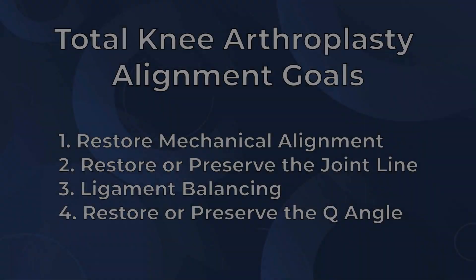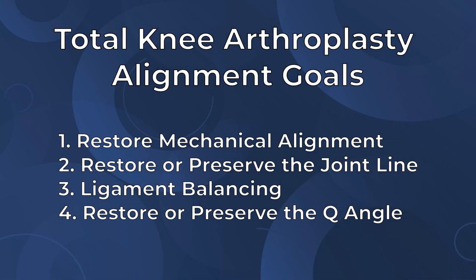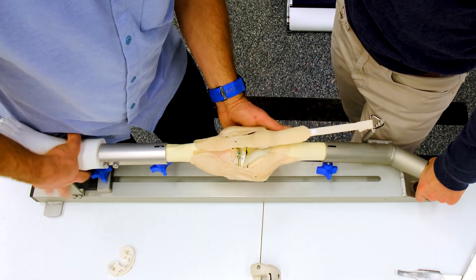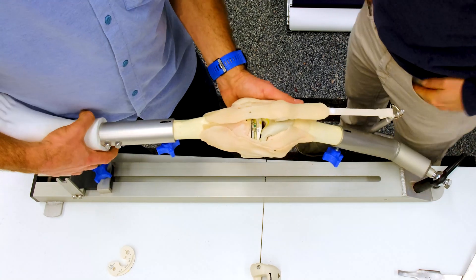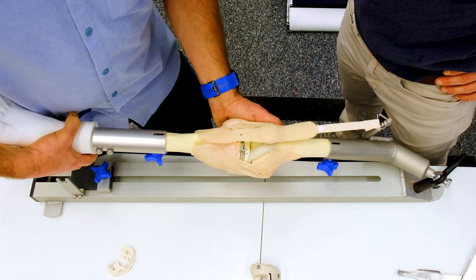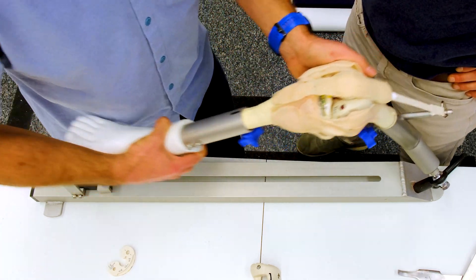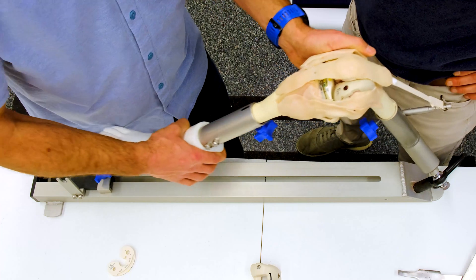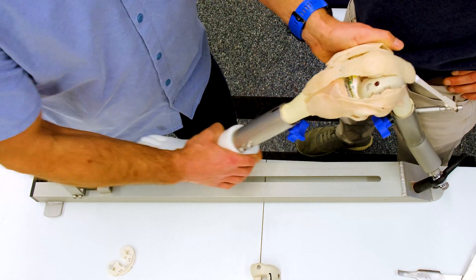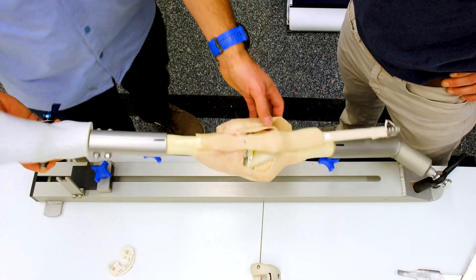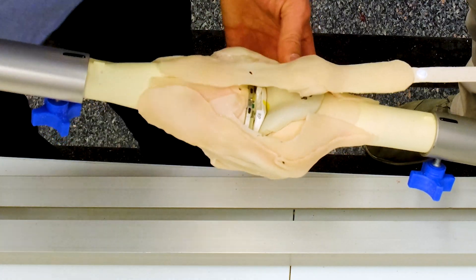We have just gone through a demonstration of a total knee replacement. We're at the trial stage and we've taken our knee through a range of motion just to see how we like our positioning. And we're not seeing what we like. The obvious problem here is that our patellar tracking is off. Going from full extension, our knee is well balanced and we don't have a flexion contracture.